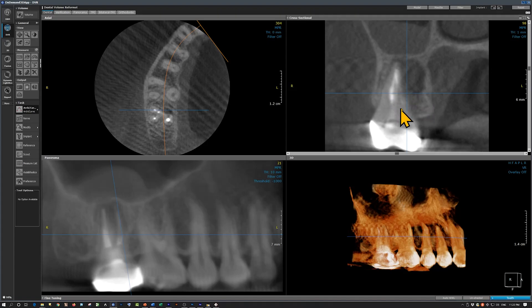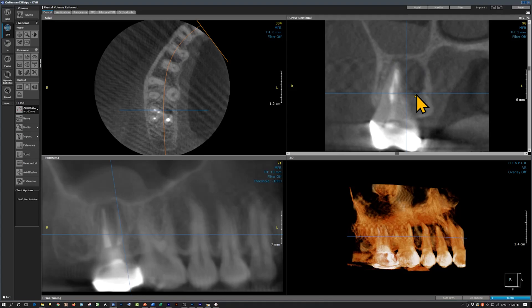Although this tooth was endodontically treated, we still have a periapical lesion with perforation of the palatal cortical plate and elevation of the sinus floor. These findings are consistent with a recurrent apical periodontitis.